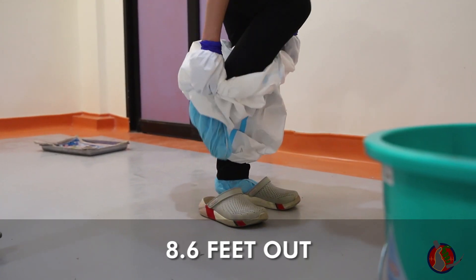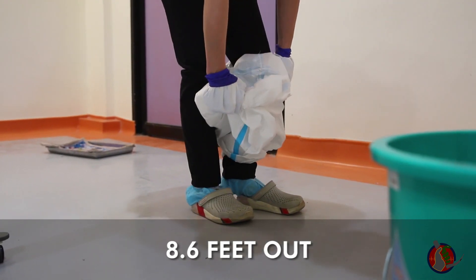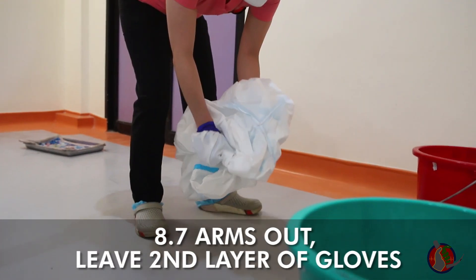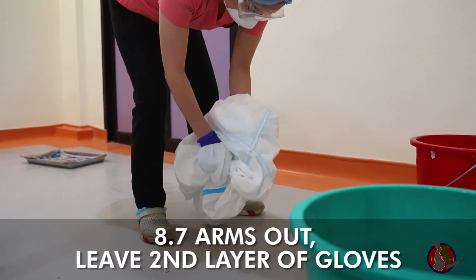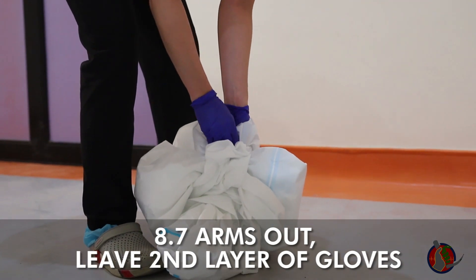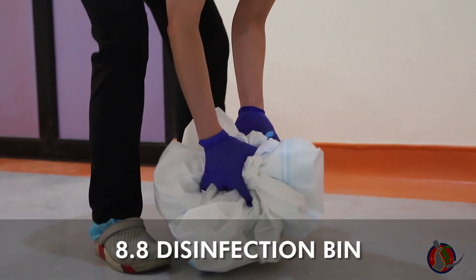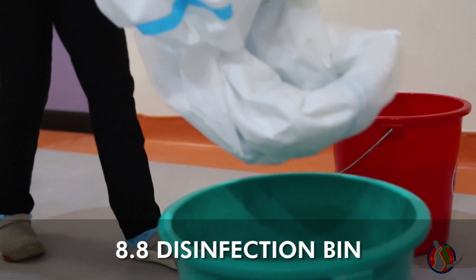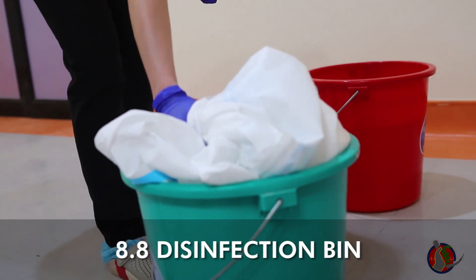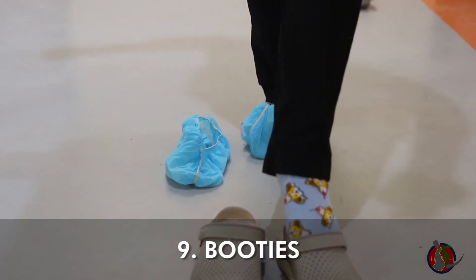Once the suit is at the knees, pull out each foot one by one, keeping the booties on. Continue rolling the hazmat suit inside out and take out arms one by one, leaving the second layer gloves within the balled-up suit. Put the hazmat suit slowly in the disinfection bin. Remove booties using the contralateral foot and throw carefully.